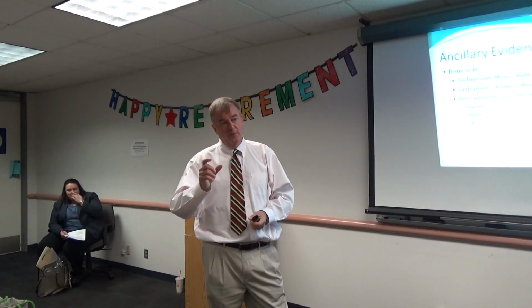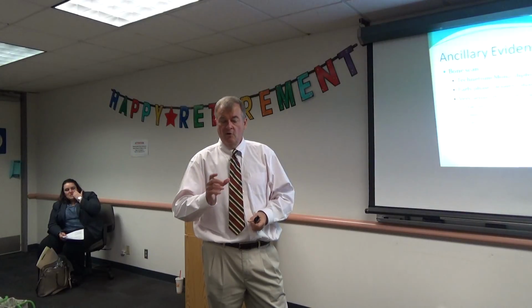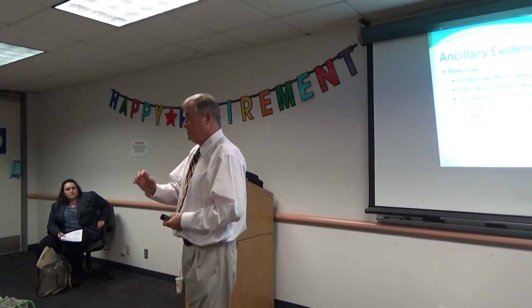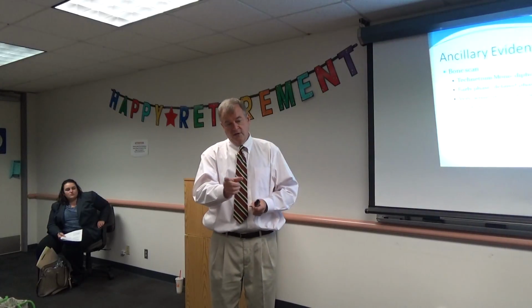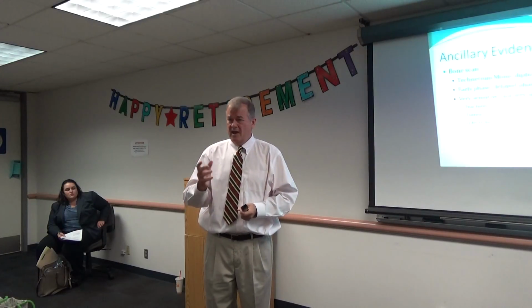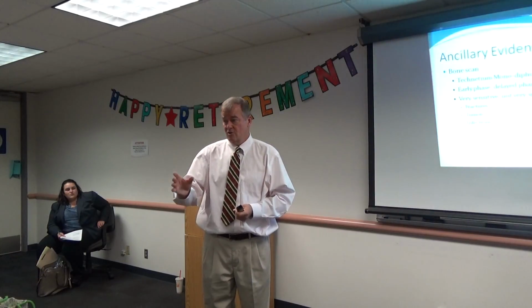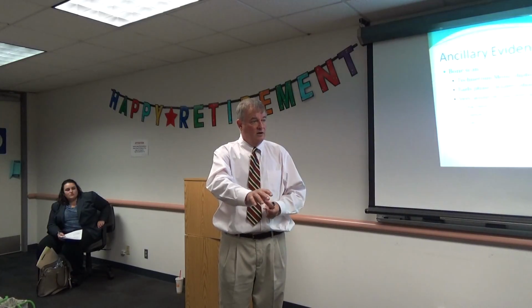And what's nice, remember, the problem is when we do electronic films now, I mentioned this, when you get a disc of films like from Children's Hospital or Loma Linda, remember, it's not like a JPEG file. It's not like taking a photo on your phone and sending it to somebody's email. When you put the disk in the machine, you have to open up the entire disk operating system. It's very analogous to if you gave somebody a Microsoft Word document on disk, that you'd have to give them Microsoft DOS to install on their computer every single time. So it takes a long time to open up films on a computer this way.